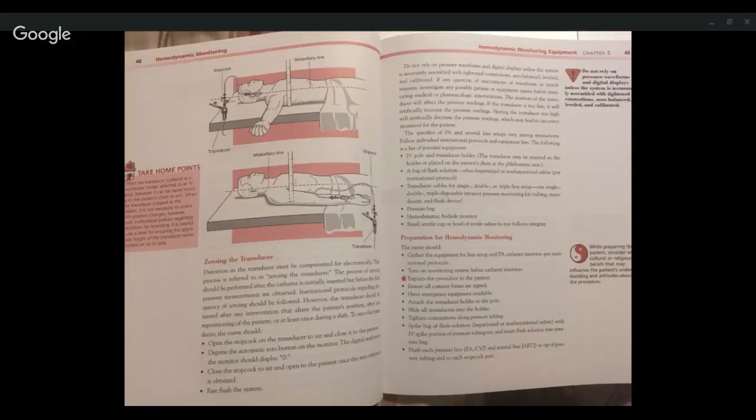The specifics of a pulmonary artery and arterial line setups vary among institutions. Follow individual institutional protocols and equipment lists. The following is a list of potential equipment: IV pole and transducer holder. The transducer may be inserted in the holder or placed on the patient's chest at the phlebostatic axis.